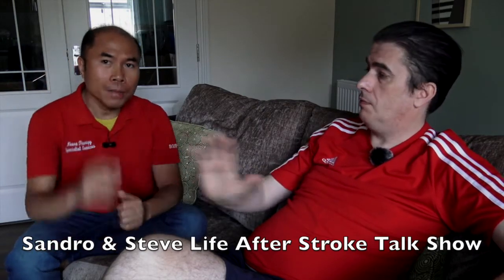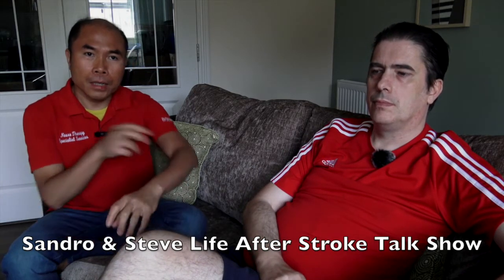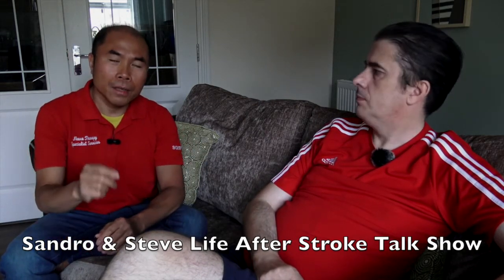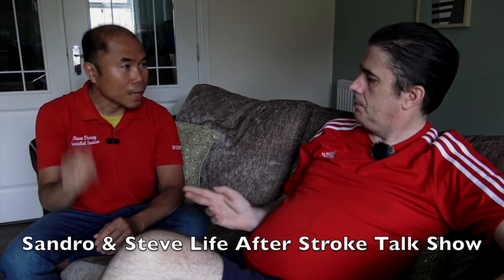A lot of mistakes people make is actually when they put the electric muscle stimulator on and then they're not doing anything. It's being passive. This is not going to be a passive exercise. If you have to make this work for you, it has to be active assisted.